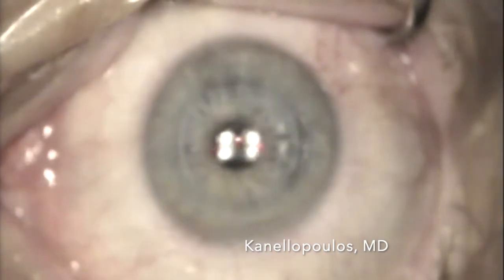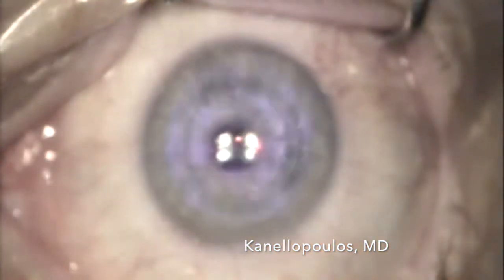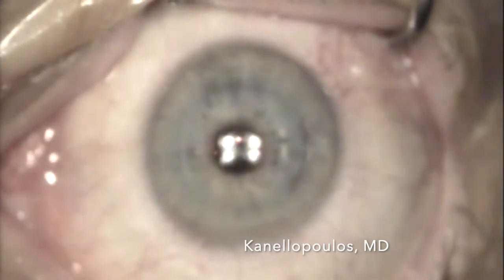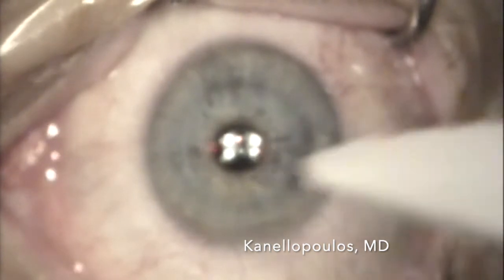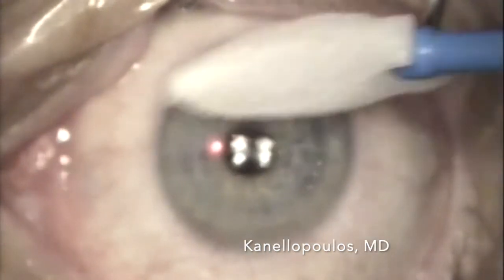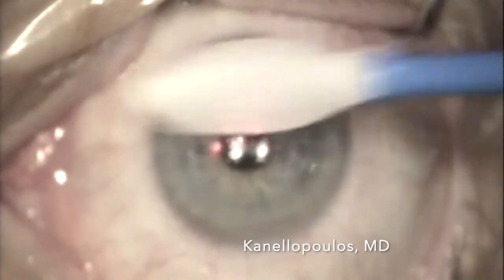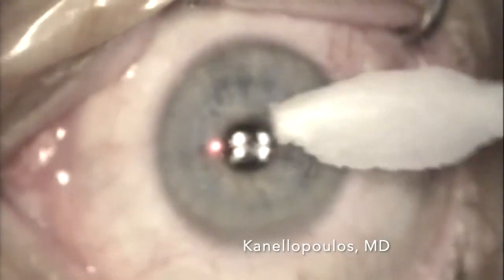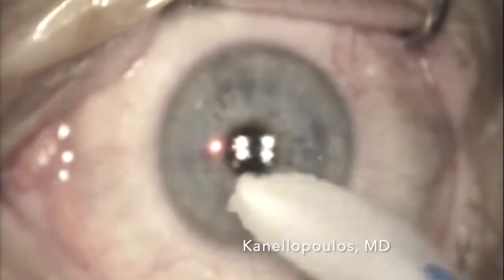You can see how we're preserving all the central epithelium and all the epithelium outside the hyperopic correction. We're making sure the hydration is homogeneous during this ablation. A small amount of astigmatism was treated. Now we're going to apply mitomycin C and expose just the area of stroma that was treated. Remember, the central cornea is untouched — this is a trans-epithelial, minimally invasive PRK.